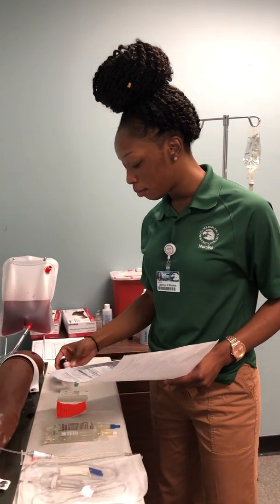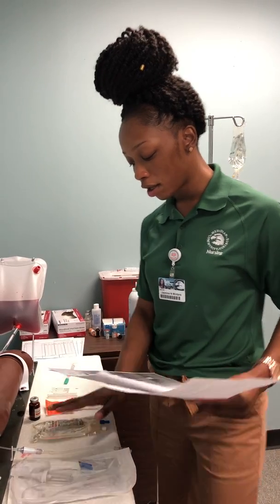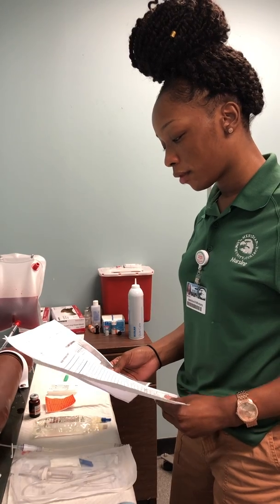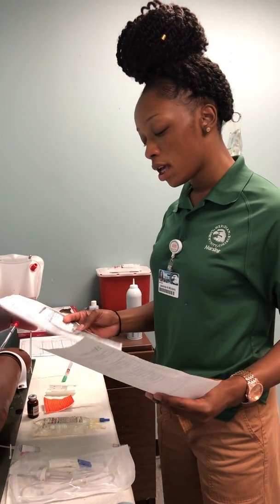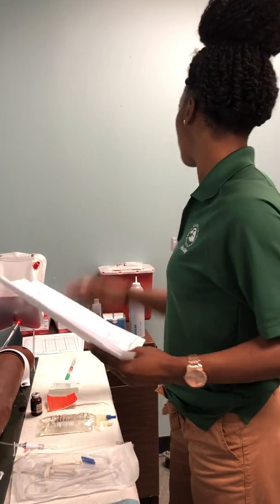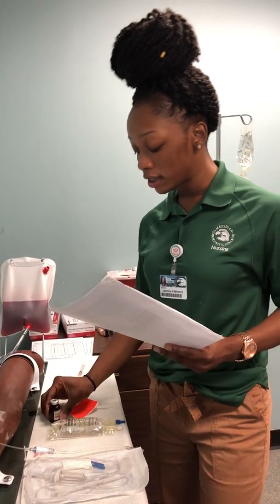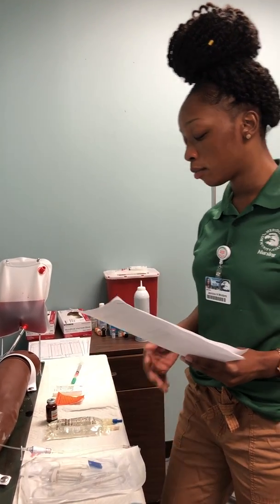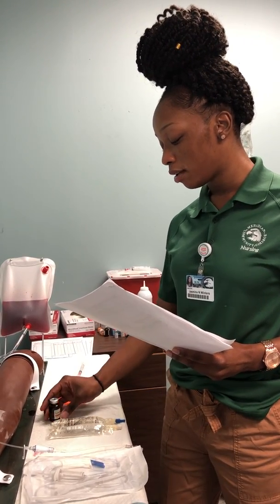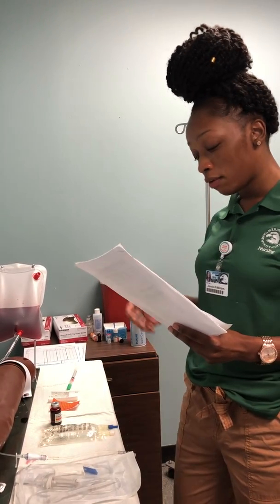Then I would check the medications with the MAR, which is Lasix 30 milligrams, and I have my gentamicin 60 milligrams. I've already checked and made sure it was a safe dose, and the gentamicin is correctly diluted in 100 milliliters, and it is compatible with the D5 that I already have hanging, as well as the Lasix is compatible. And the rate of 17 drops per minute, and I'll give the Lasix over 1 to 2 minutes undiluted. It can be given undiluted.